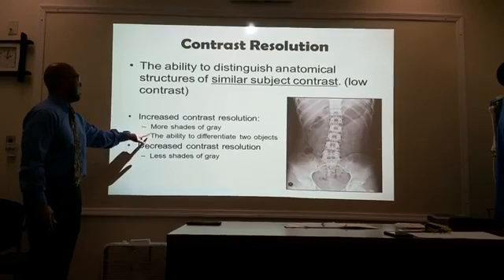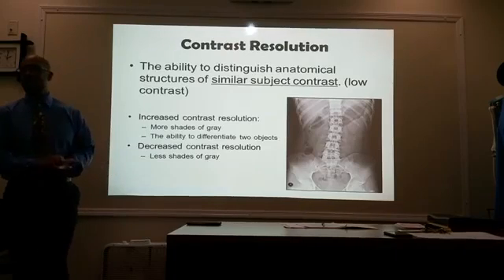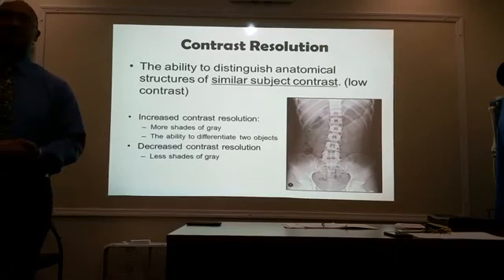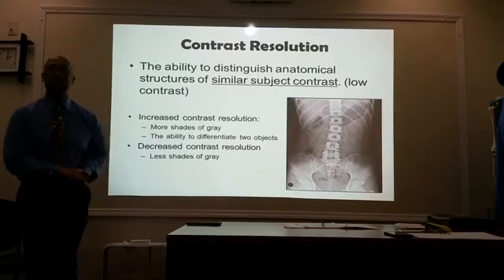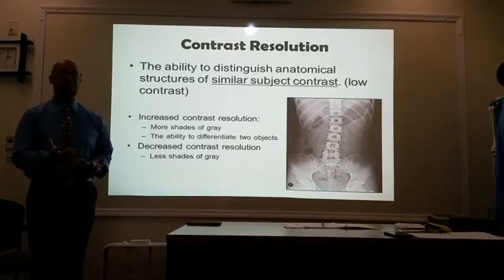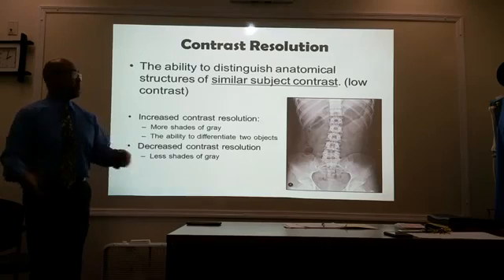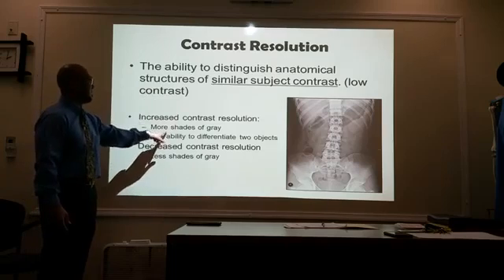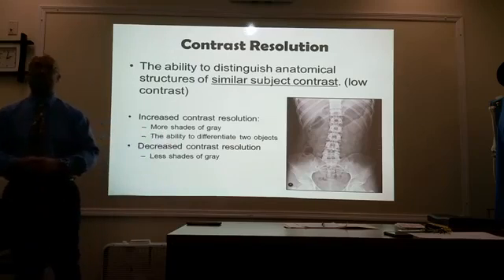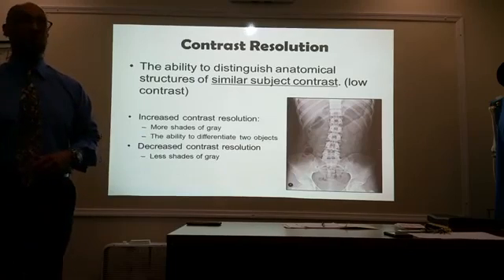If you have increased contrast resolution, that means there are more shades of gray. Don't confuse this with high radiographic contrast, because when we say high contrast, we're saying it's black and white. When we're talking about high contrast resolution, that means there are more shades of gray. We are able to delineate the very similar structures.